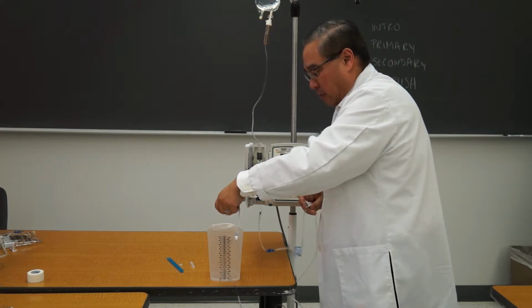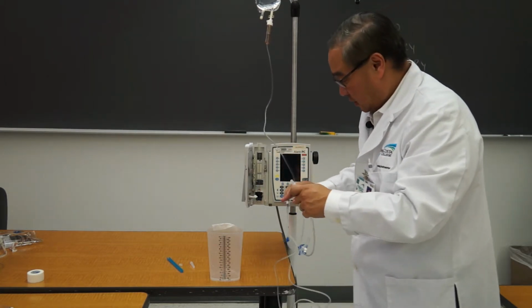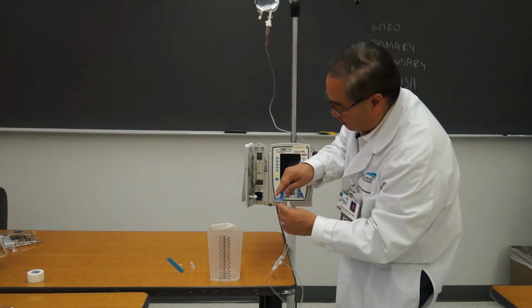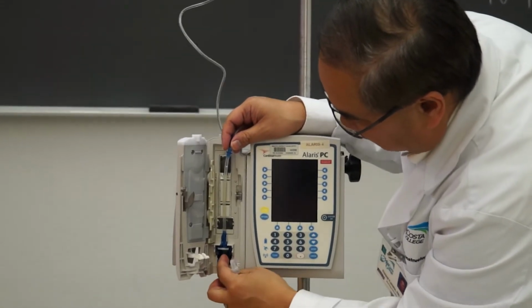That's about 5 drops, 6 drops, 7 drops. That's all I've wasted, about 7 drops. It's hardly anything. Now, just like in the earlier video, I'm going to match up the blue to the blue here. And I'm going to push the blue end in first, okay? There's no kinks here, it's straight through.